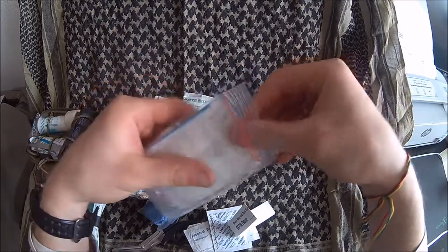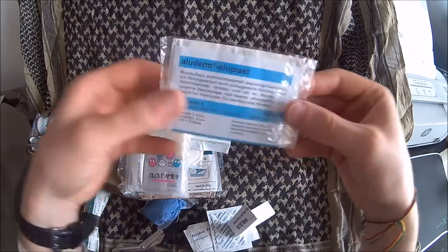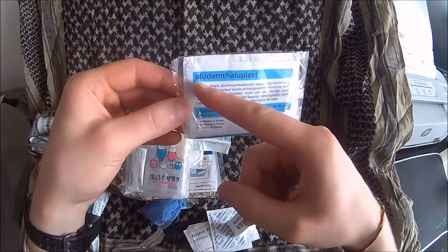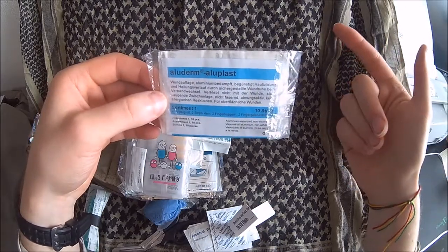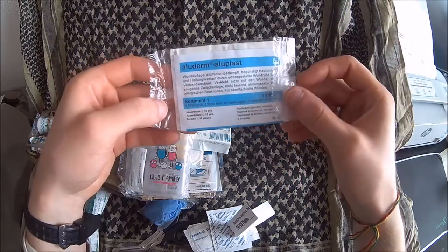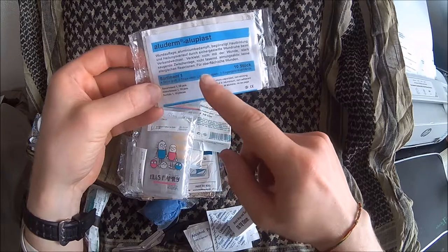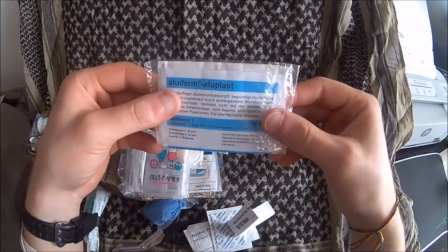No real first aid kit can live without some band-aids or plasters. This is a complete set — these are also aluminum-treated so they won't stick to a wound, very absorbent, and super sticky on basically any surface. You've got your strips, large ones, small ones, then your fingertip bandages and knuckle bandages — everything you could possibly need right in this pack.